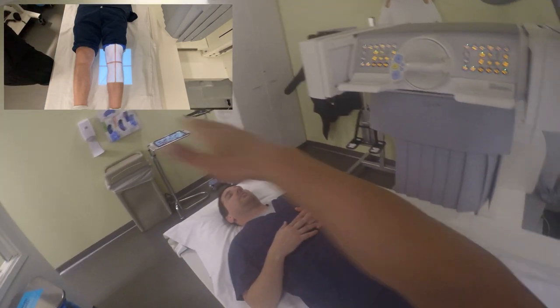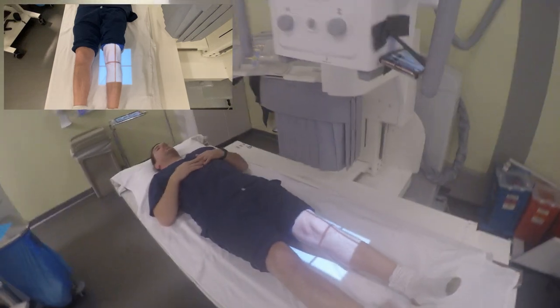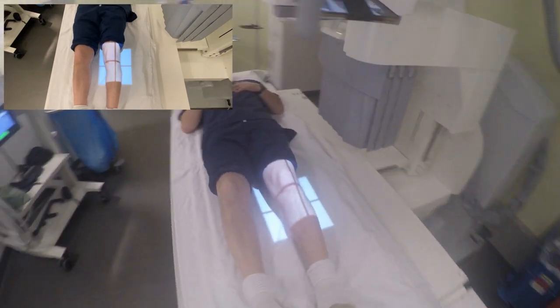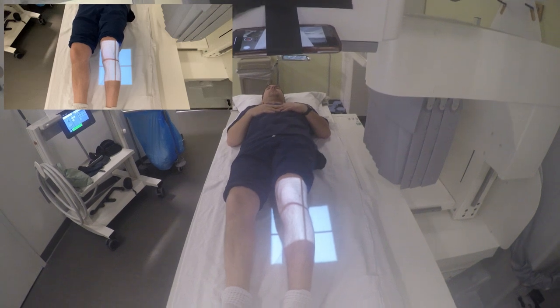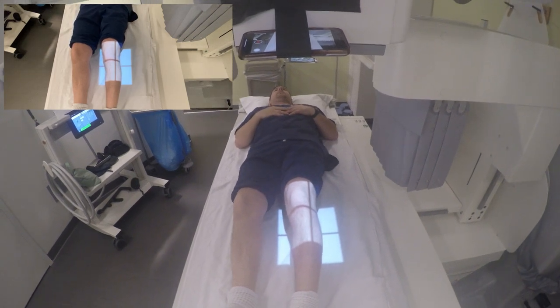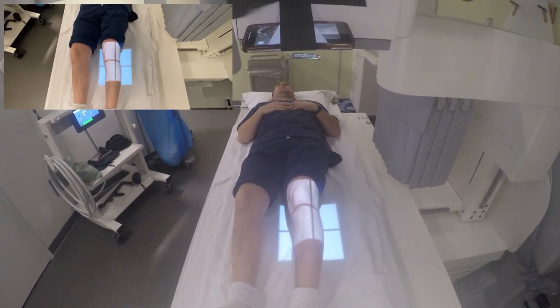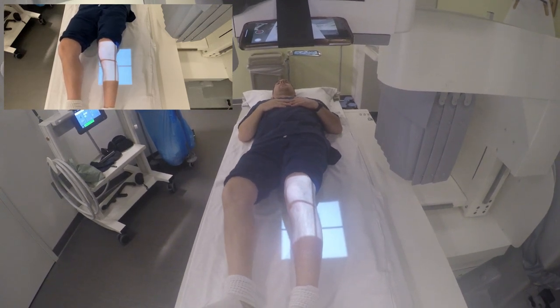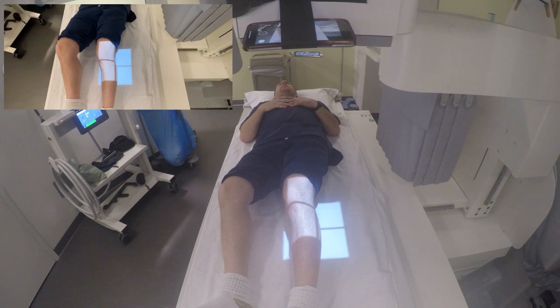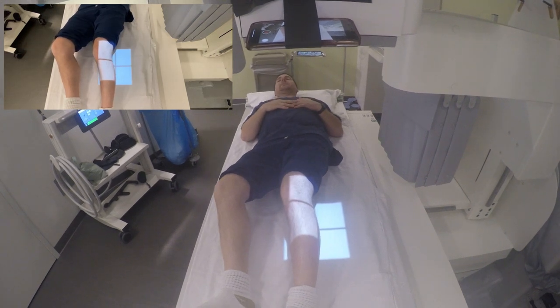So your knee is straight up to the ceiling — I need you to rotate inward at a 45-degree angle; you may need to rotate your hips for that. Precise instructions: I not only use my voice but give a visual aid and show the patient what I need them to do. Most people know what 45 degrees is, and if they don't, I demonstrate with my hand. I also add that they may need to rotate their hips for this position.